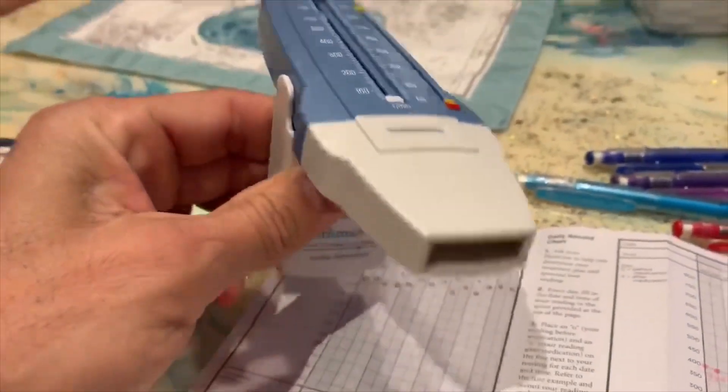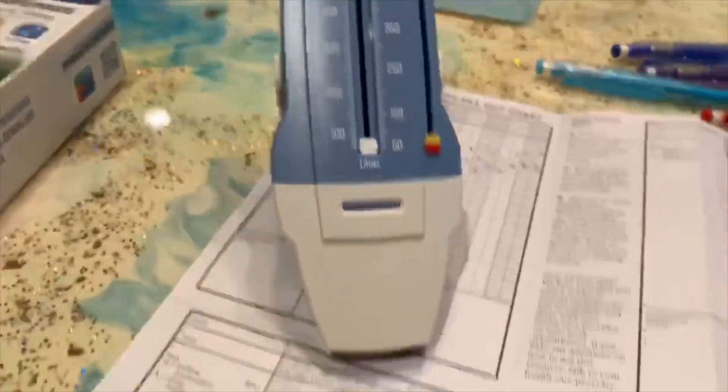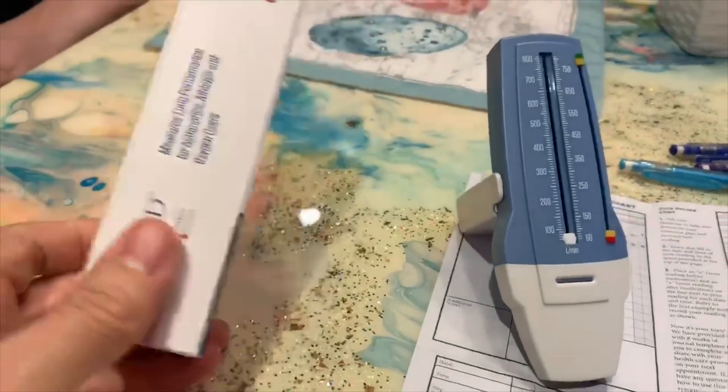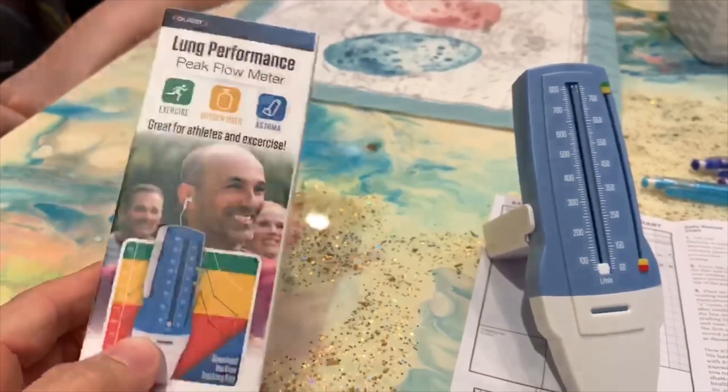Very easy thing to use. You just hold it up to your mouth, blow into it, and this little meter here pops up and tells you where you're at. We're going to test everybody in the household to see if anybody is getting the flu or possibly the coronavirus. A decrease in lung capacity will usually come before a fever. We'll wipe it off between each person with an alcohol pad. These are only about $10 to $20.